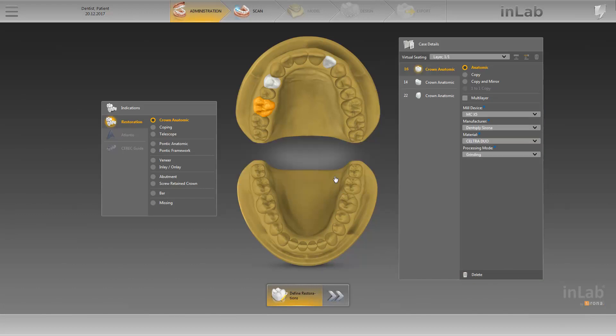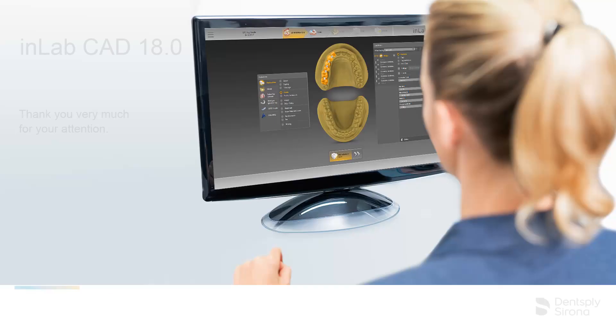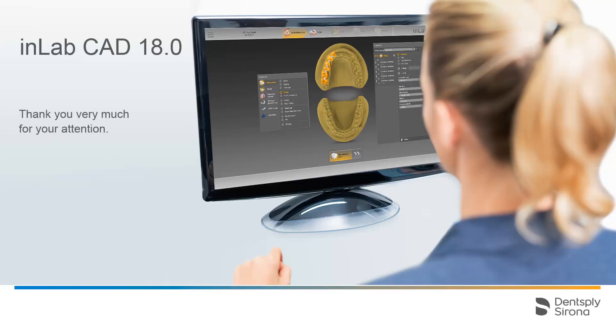And now we can switch to the next phase, the Scan phase. Thank you very much for your attention. We would like to wish you every success when working with InLab.